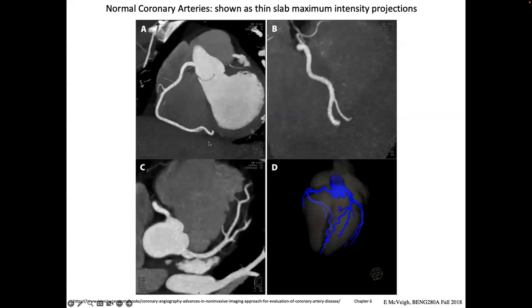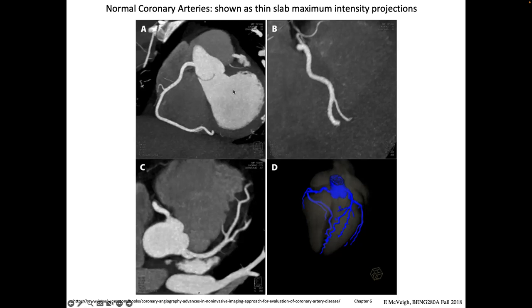To view coronary arteries in a planar format, you take the 3D data, select a slab containing the right coronary artery, and perform a maximum intensity projection (MIP) through that slab — projecting whichever pixel has the highest intensity onto one side. This gives a cross-sectional view of the coronary artery and is used extensively by radiologists and cardiologists to read coronary angiograms.